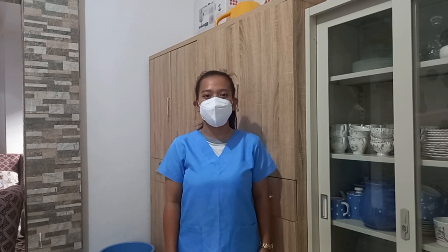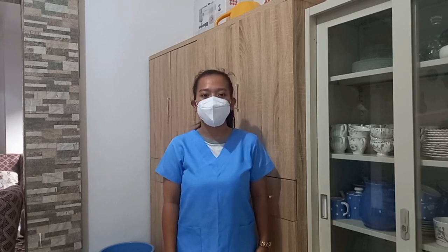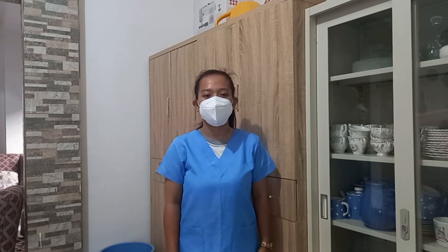Hello, my name is Nicole Finita-Lapare and today I'm going to perform a turn demonstration about assisting a patient with ambulation using crutches.